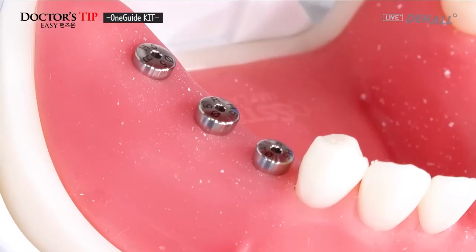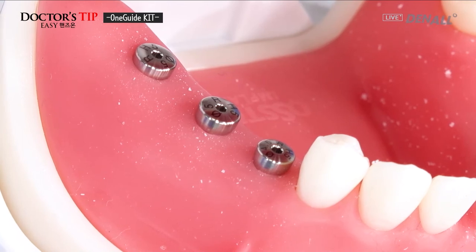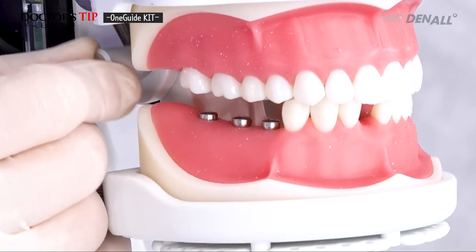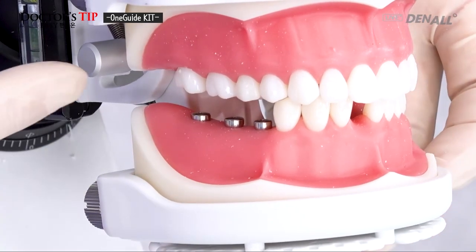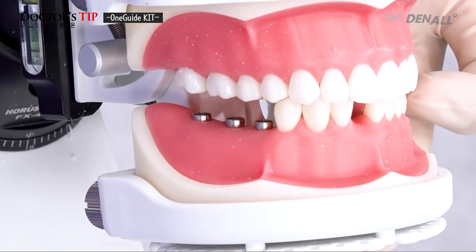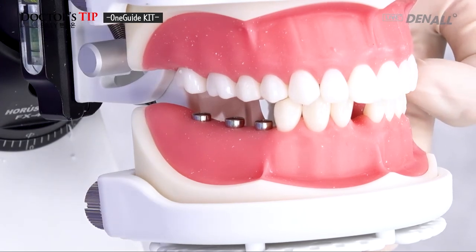Three implants, 45, 46, 47, have been planned using CBCT, and we have placed the implants in the planned area, and you can check it with your own eyes. When using OneGuide, if you start off with a difficult case, there's considerable chance of there being deviation. It requires a learning curve.